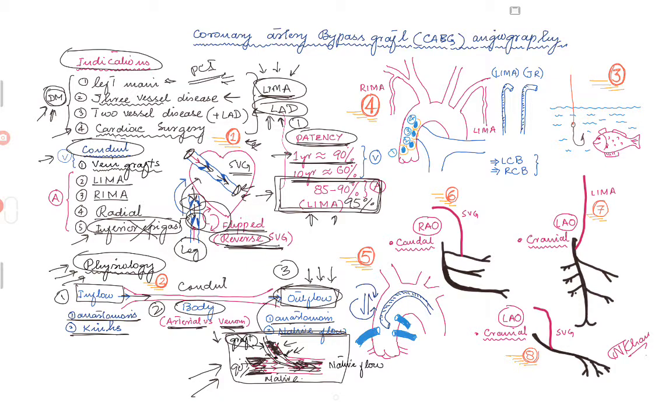And for this reason, sometimes if you have an intermediate lesion, we can consider doing an FFR in these patients to truly define if that lesion is physiologically or hemodynamically significant.